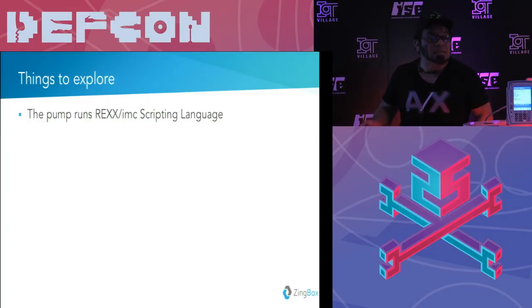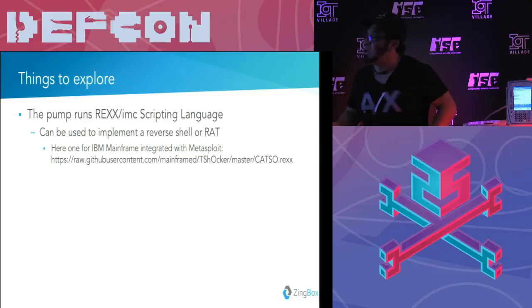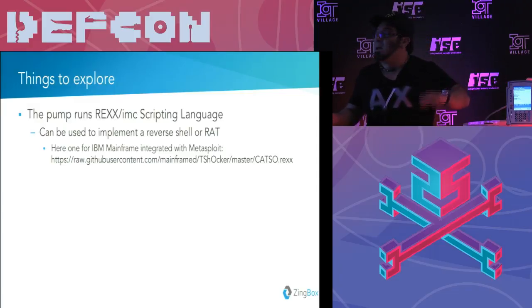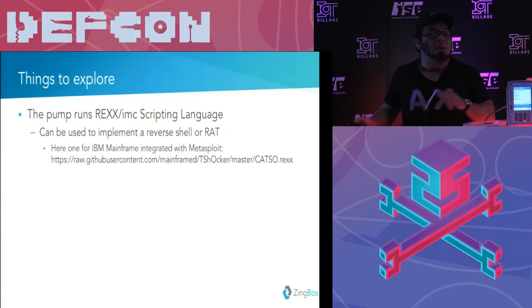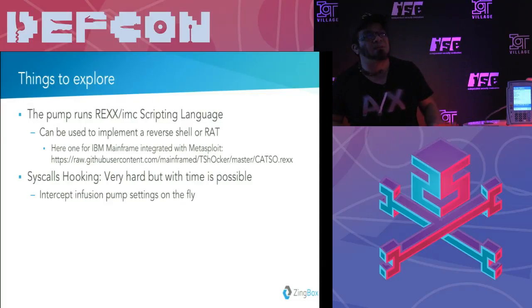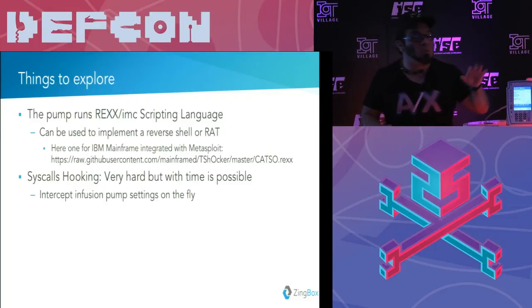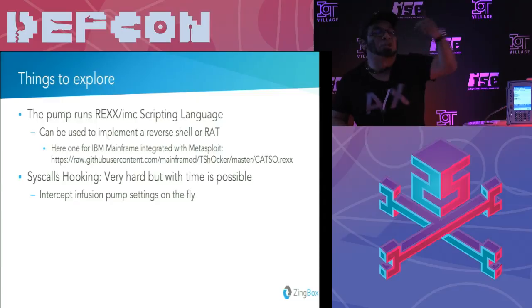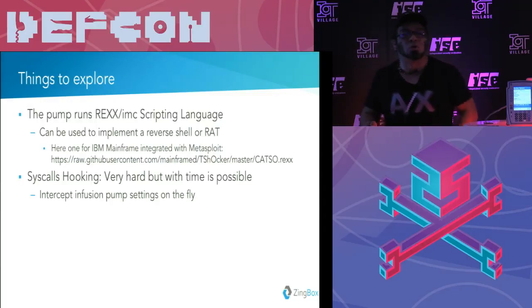We can play with the Rex scripting language that I said will help us to create RATs or reverse shells. I actually found an implementation of this Rex scripting language that is running on this guy. One guy already implemented it on an IBM mainframe, so it's totally doable. Syscall hooking, that's very advanced because this guy doesn't have symbols. But what you can do here is intercept the calls of the VTBI, the rate, and change it in memory on the fly, which is very hard, but it's possible with time. We're going to try to do that.